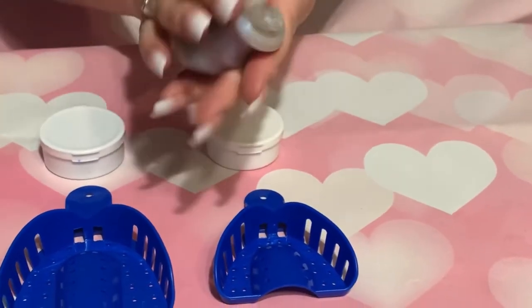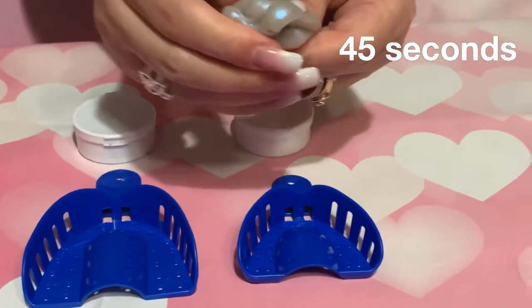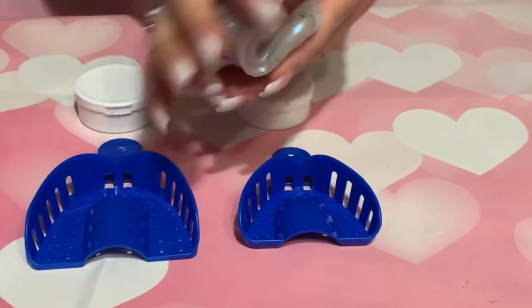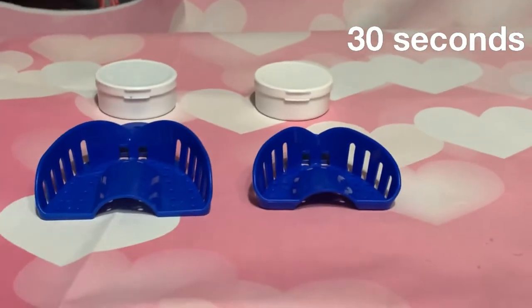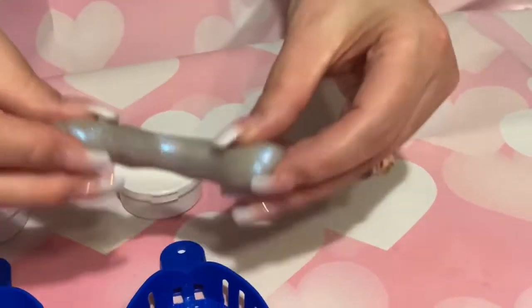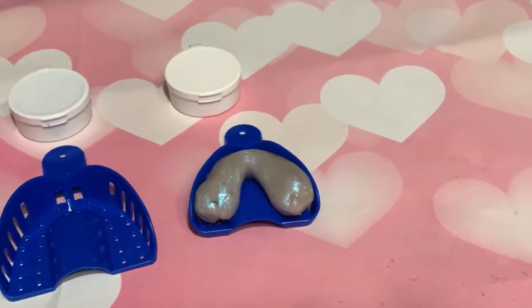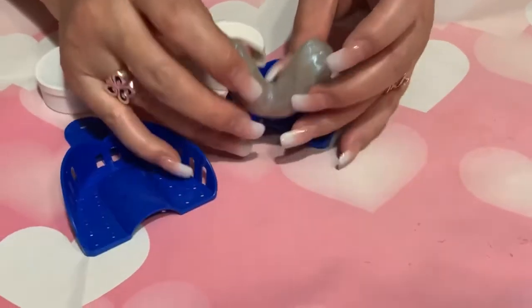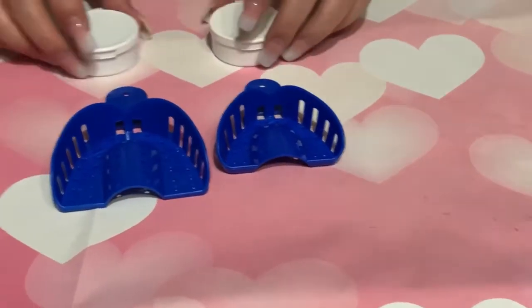Now, it says not to exceed 45 seconds. So we're going to have a timer on so that in about 30 seconds, he's going to stop bending and folding it so that he can start rolling it. You're just going to roll it like this. And then you're going to put that inside the tray, similar to that. Once that's in there, then you're going to pop the tray in your mouth.